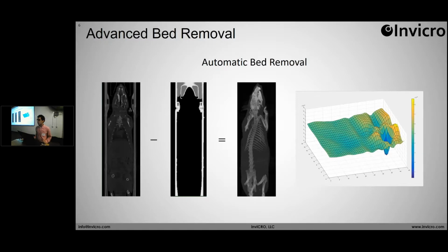We had to make a number of optimizations to make sure the 3D algorithm was quick, and we noticed quite a few interesting aspects of the optimization curve. When you're aligning these two things in 2D, for instance, you have quite a few local minima that you have to get around, and you can clearly see the global minimum here in the alignment, where this is the similarity cost function. Getting into that space was really the challenge, and I think we've done a good job of that here.